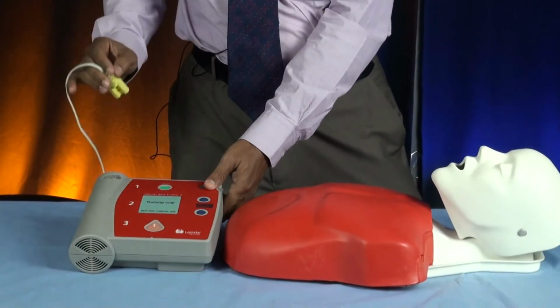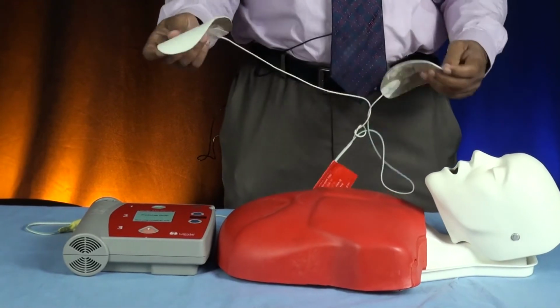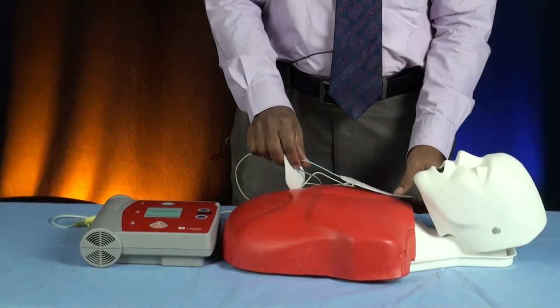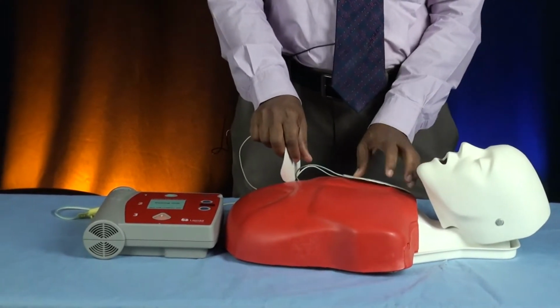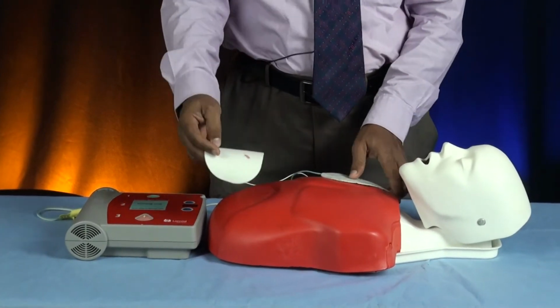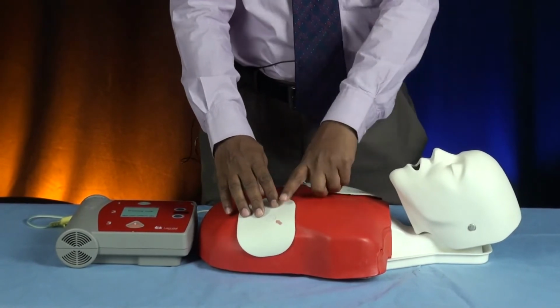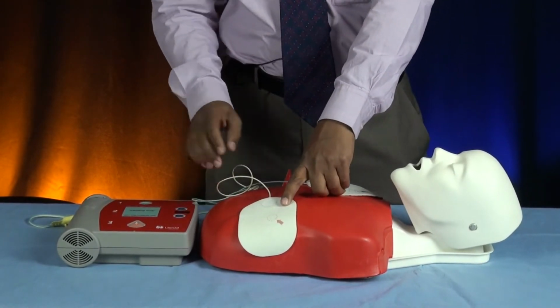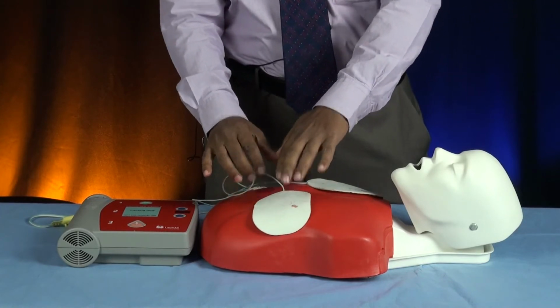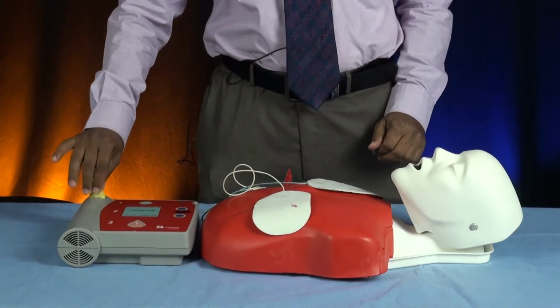Here, first, one of the pads is connected to the upper right of the sternum. The other one is at the apex, or lower left. Upper right and lower left. This is the connection to the machine. And don't forget to connect to the device.